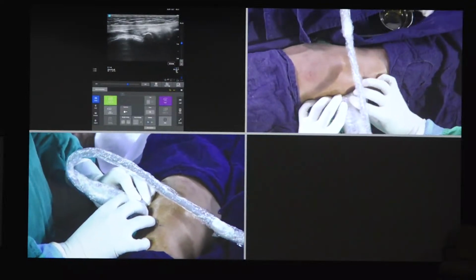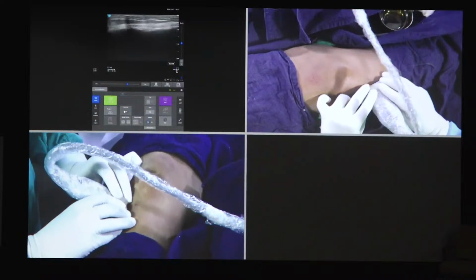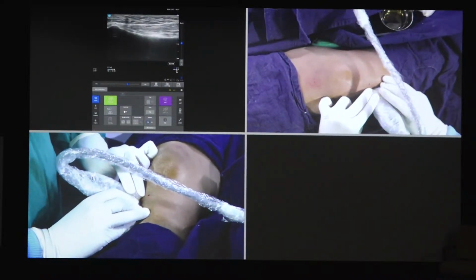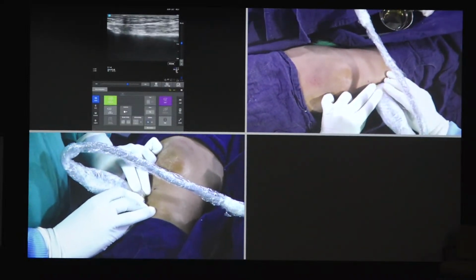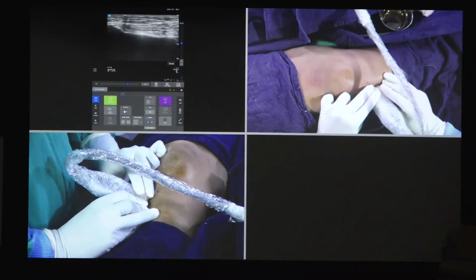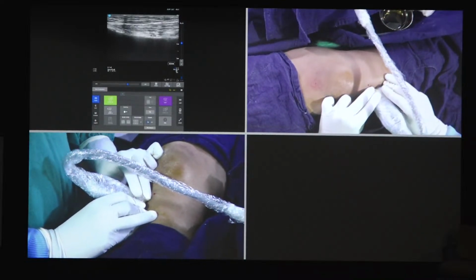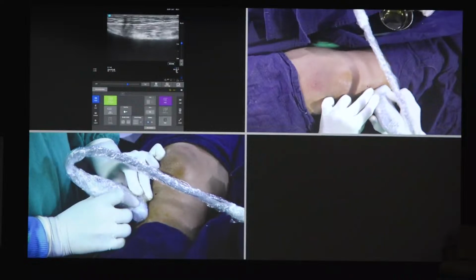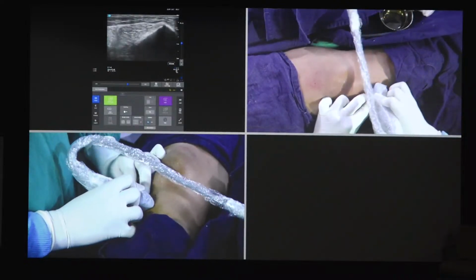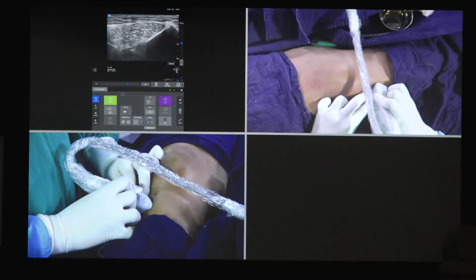So basically again this is the iliotibial band on the top, what you're seeing attaching onto the tuberosity, and as you go down you will see the tibialis anterior muscle along with the pulsation also. So in the center you can see the genicular artery. So this is where we do the RF ablation. Again turn, rotate it, see the artery in long axis, and we do the RF ablation.